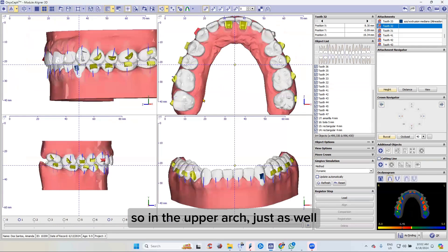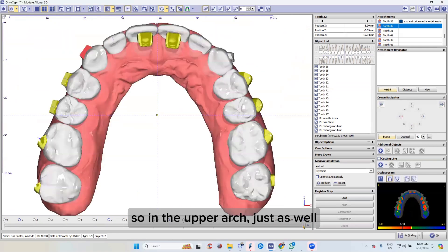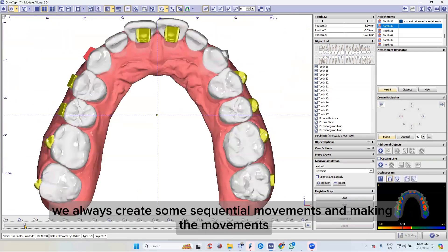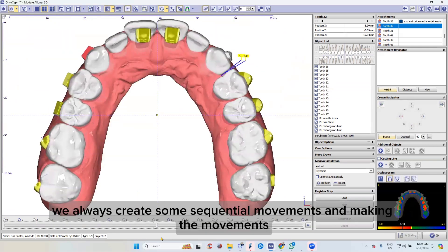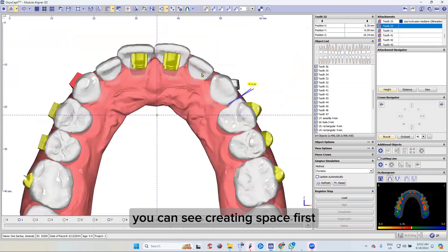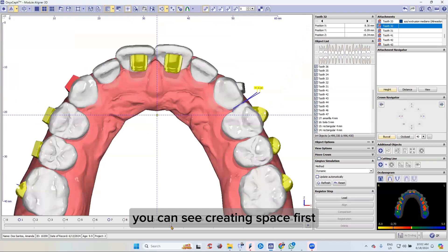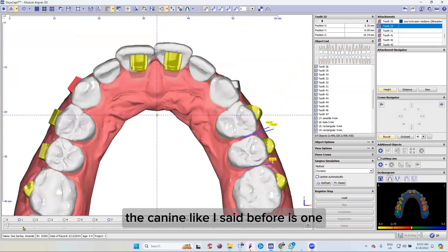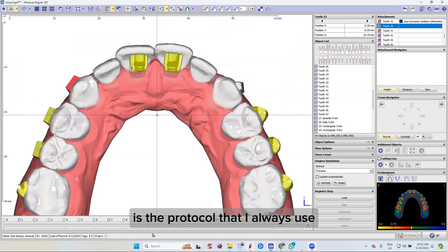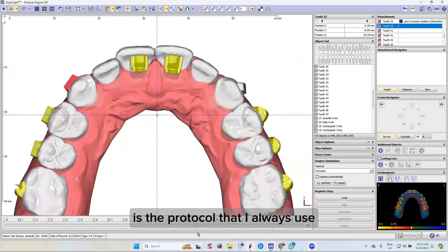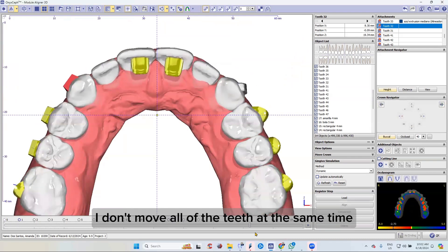In the upper arch as well, we always create sequential movement — you can see space being created. First the canine, like I said before, is the protocol that I always use. I don't move all of the teeth at the same time.